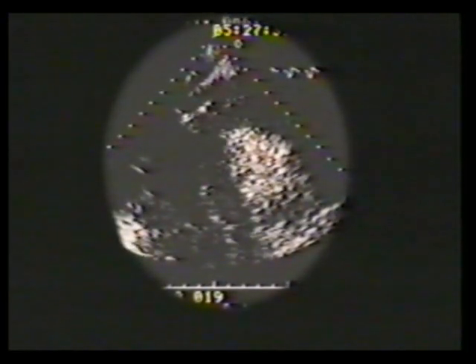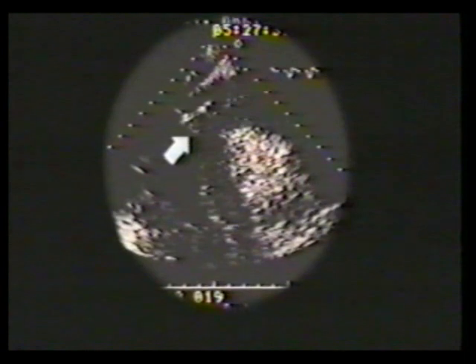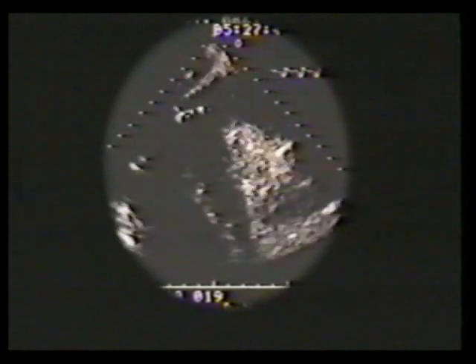This is a suprasternal view from the same patient. Markedly enlarged ascending aorta, arch, and descending aorta. The intimal flap extends through the ascending aorta and spirals into the arch. Surface echo is often able to identify flaps within the horizontal portion of the arch, which is seen here in short axis.